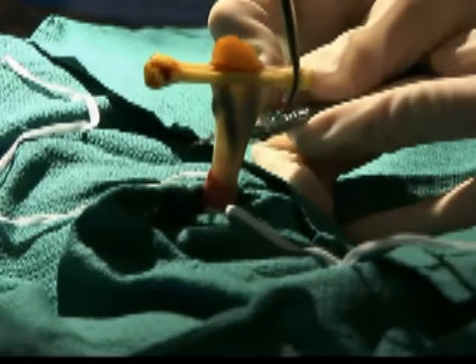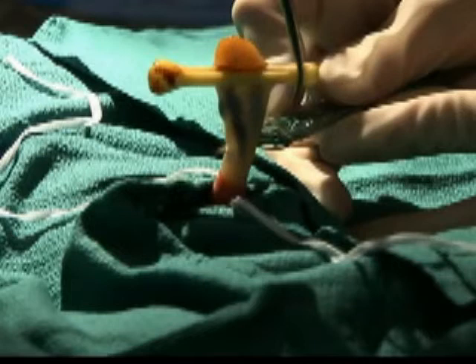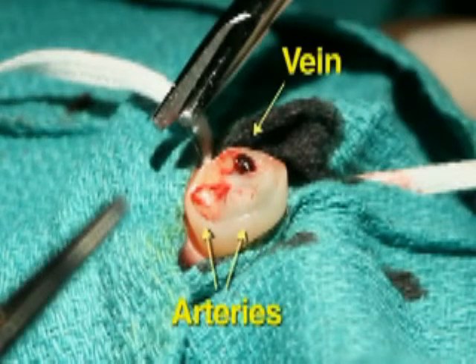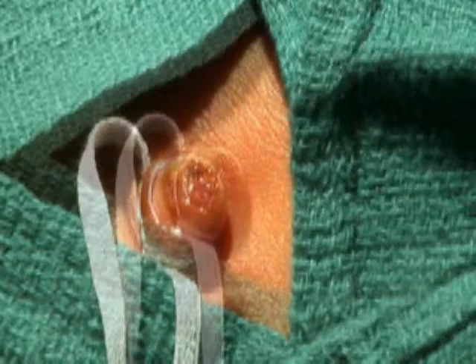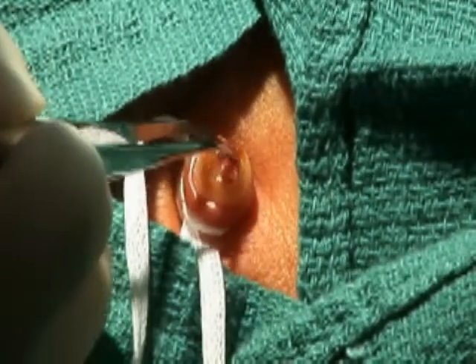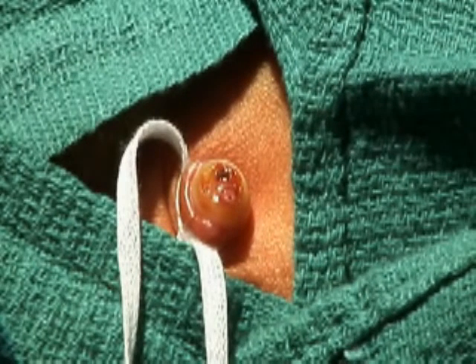Cut the cord horizontally with the scalpel, approximately 1.5 centimeters from the skin. Take care not to cut the skin at the base of the cord. Ask the assistant to remove the cut cord and clamp from the field. Identify vessels within the cord and control any bleeding by adjusting tension on the umbilical tie and by blotting, not rubbing, the freshly cut surface. While it is feasible for a single operator to place an umbilical catheter successfully, we will describe and demonstrate the procedure for an operator working with an assistant donning sterile attire.